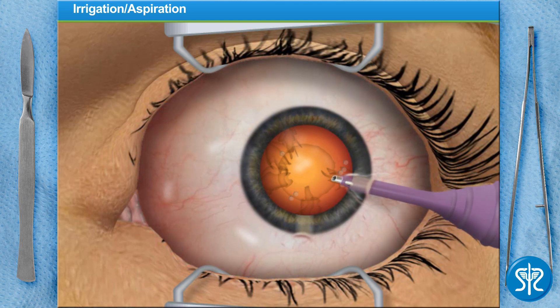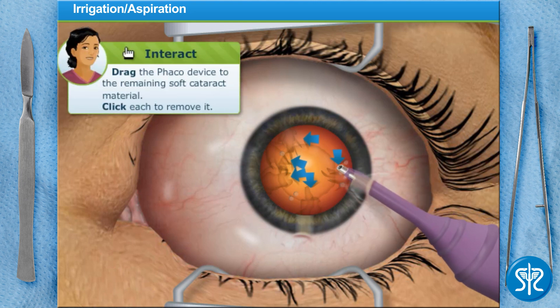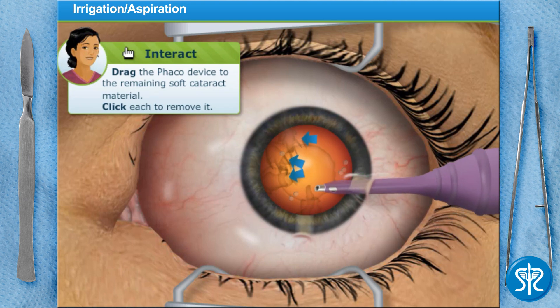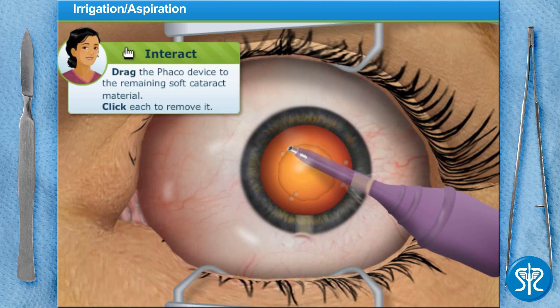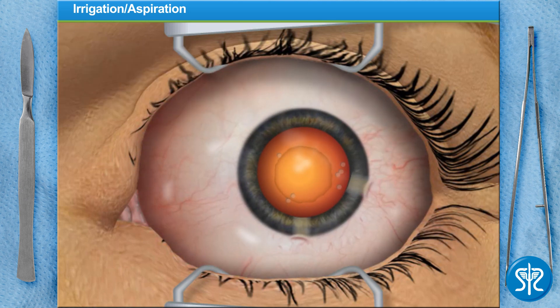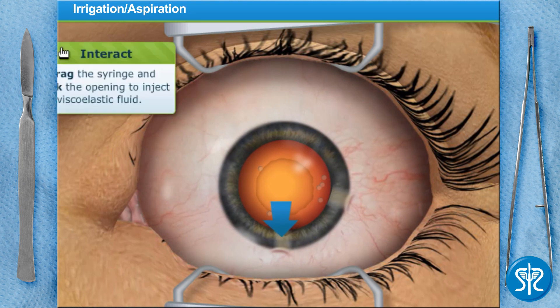I'll need you to remove the last remaining soft cataract material out of the eye, leaving behind the clear, empty lens capsule. When you're done, inject more viscoelastic fluid into the lens capsule to keep it from collapsing.